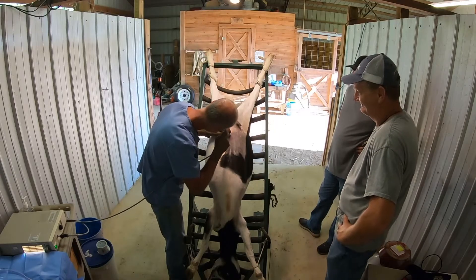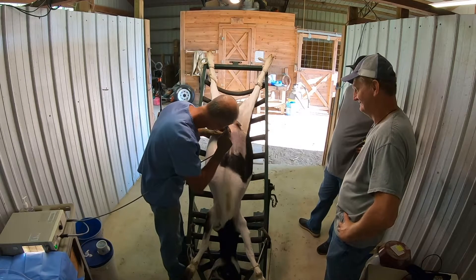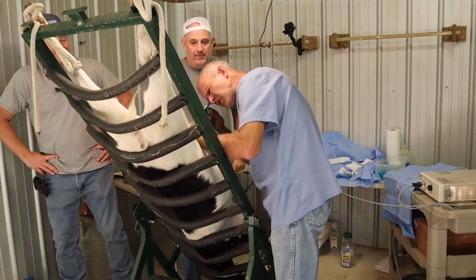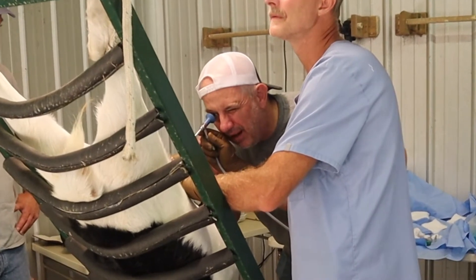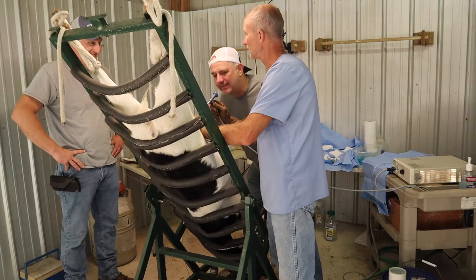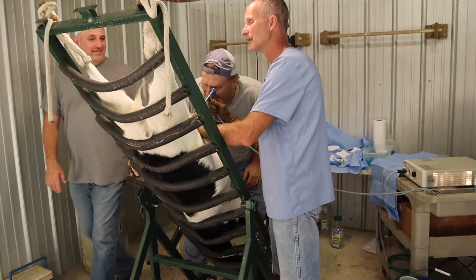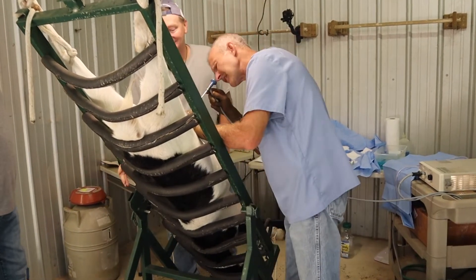If you want to have a look — right there. I mean, right there it is. There are two uterine horns sitting right there at you. Oh my goodness, that's amazing. They're sticking right there at you, just like that. Yep, that's it.